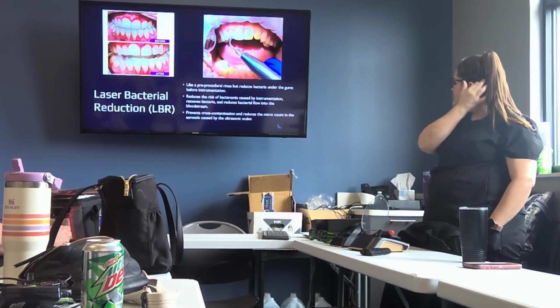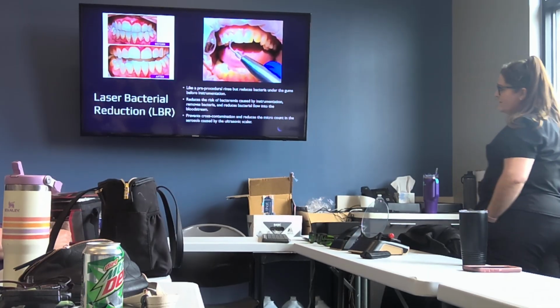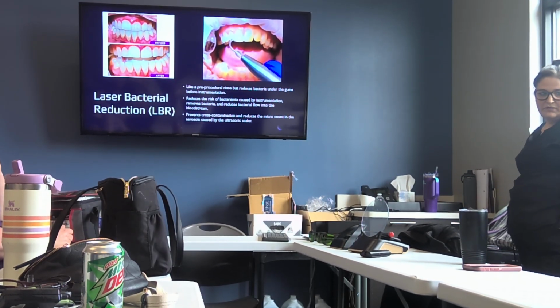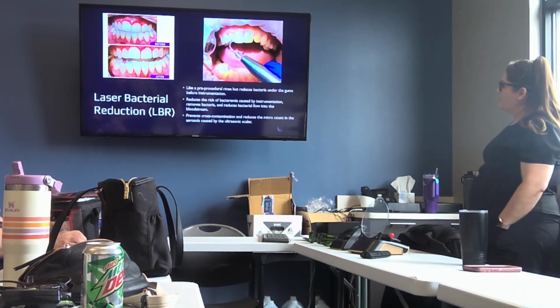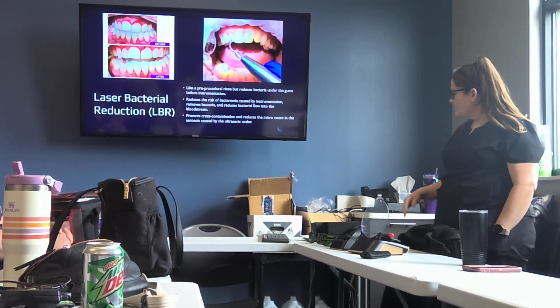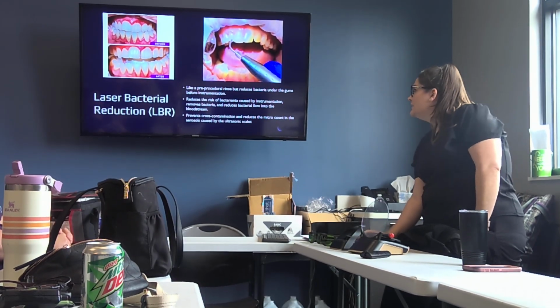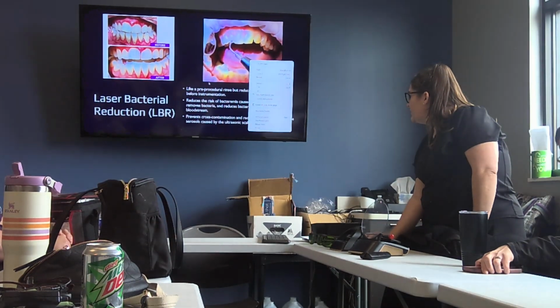It's really good at reducing the risk of bacteremia caused by instrumentation. So again, doing it before you instrument so that you're not moving that bacteria around to other areas of the mouth. That's where it prevents the cross-contamination, and it also helps reduce the aerosols caused by the ultrasonic. So yeah, I'm sad that I can't show you that video.